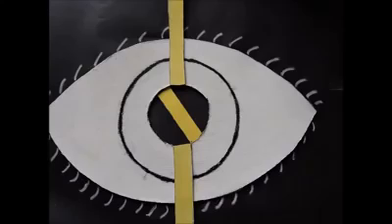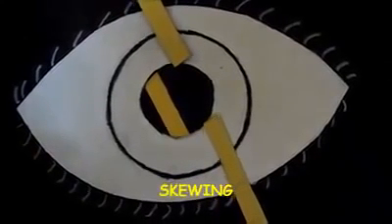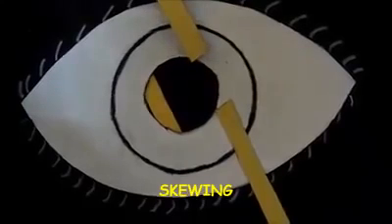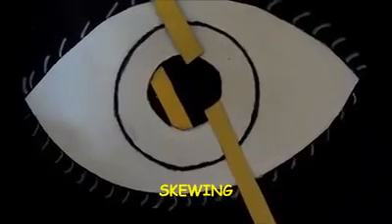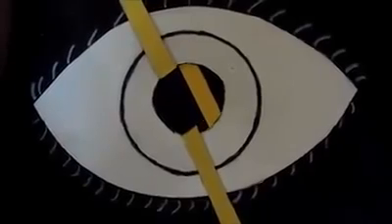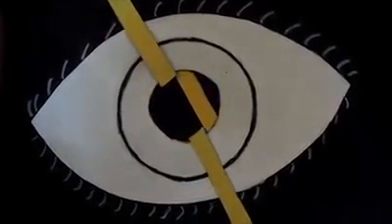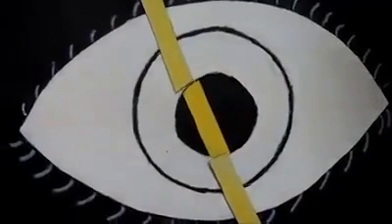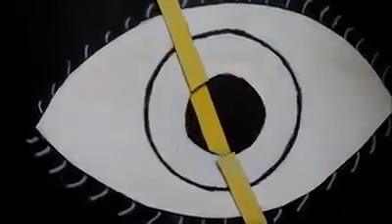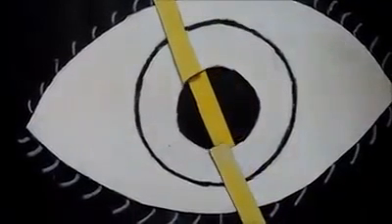To confirm whether the axis is correct or not, we perform a technique known as skewing. In this, we move the streak and observe the pupillary reflex. If the pupillary reflex moves against the streak movement, the axis determined is wrong. If the pupillary reflex moves along with the streak of the retinoscope, the axis determined is correct.